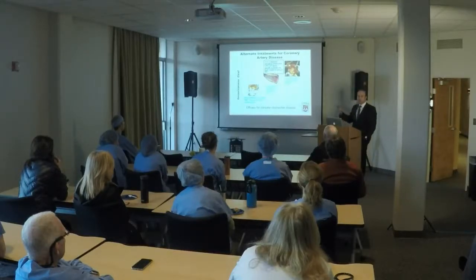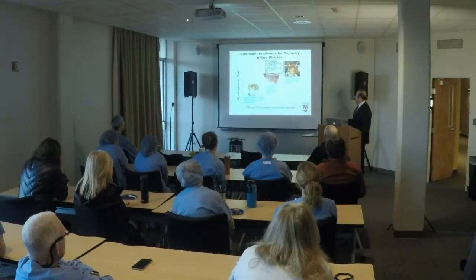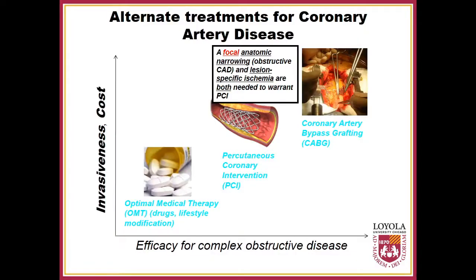But for some, they need revascularization. So they need PCI, they need bypass. And for PCI, a focal narrowing and ischemia are both needed to warrant intervention. So that brings us to FFR.